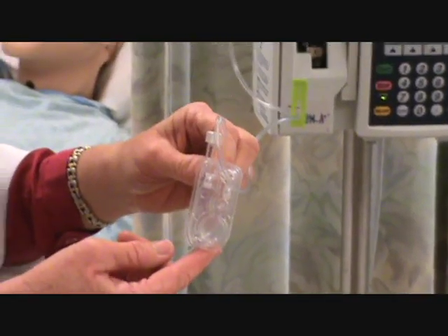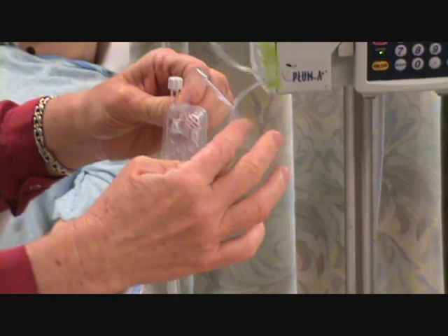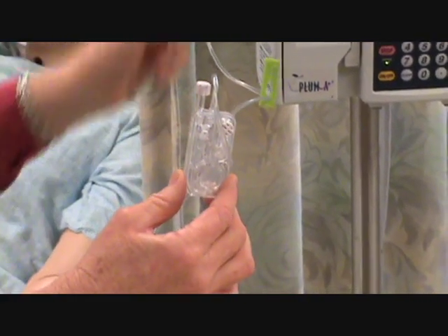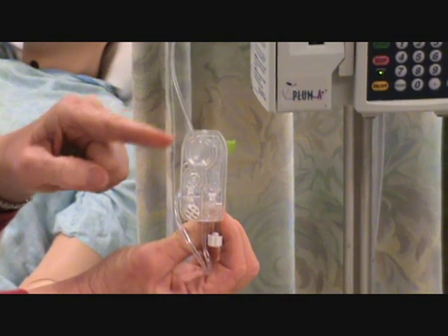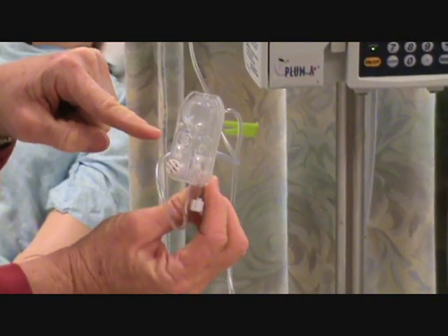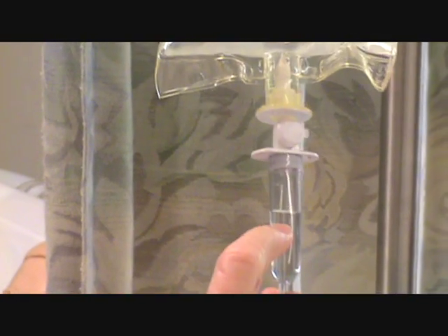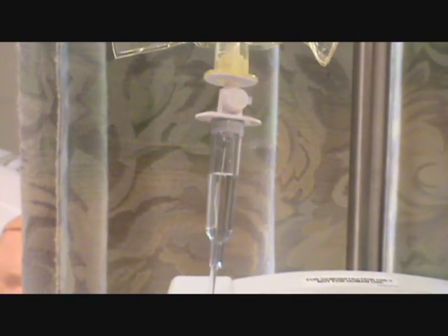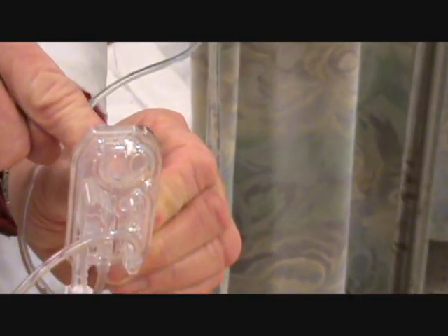Here is the cassette, and there's a little place to hold it on the back side. It is placed in the pump holding that, but when we prime the tubing we turn it upside down first. As the fluid flows through it will fill the chambers, and as the fluid gets into the large bubble we invert it — that helps force the air out. First, fill the drip chamber by squeezing it and filling it to at least the line. Then pull the little white ball lever out, see the fluid fill into the ball, then invert. All the air is then forced out through the tubing.